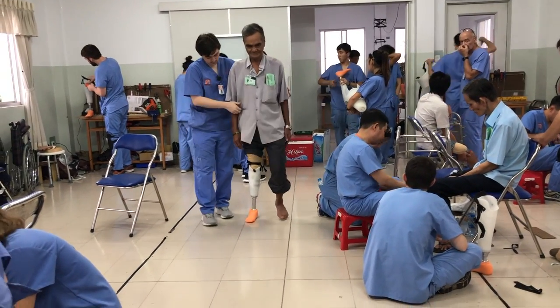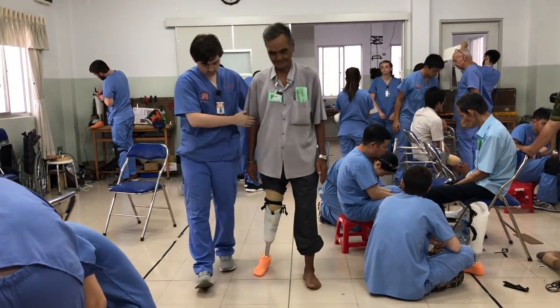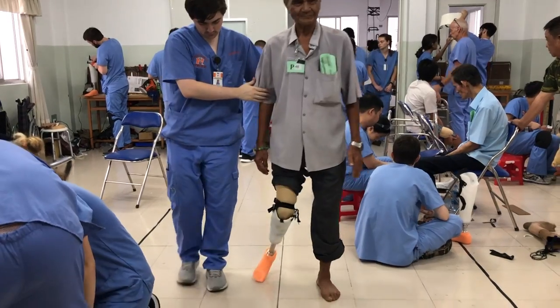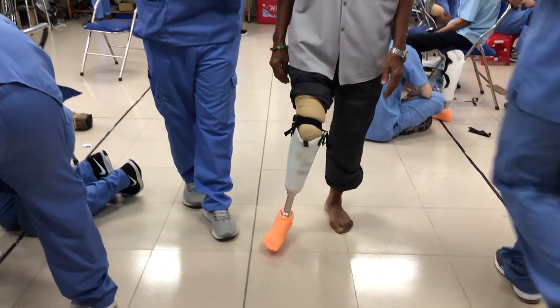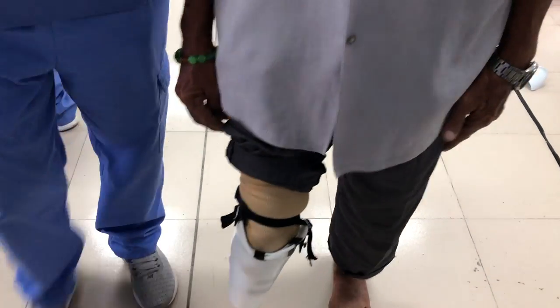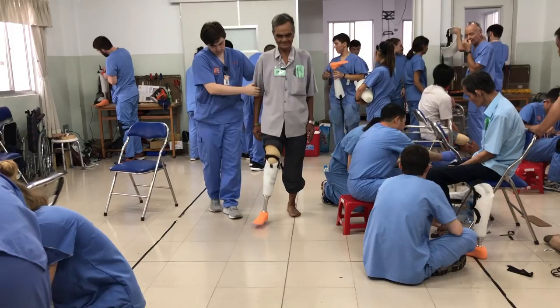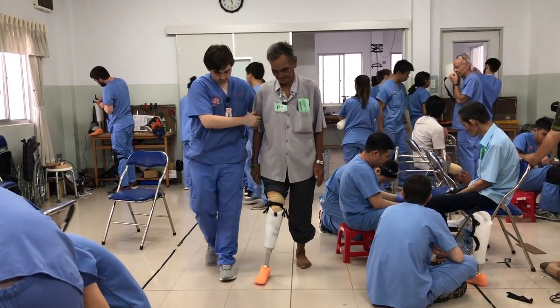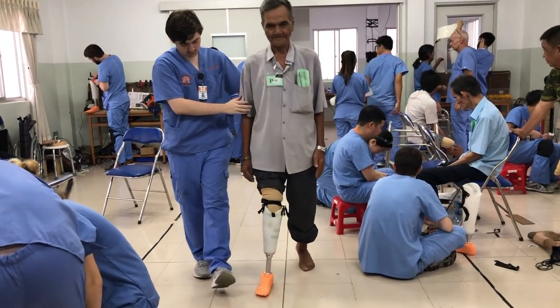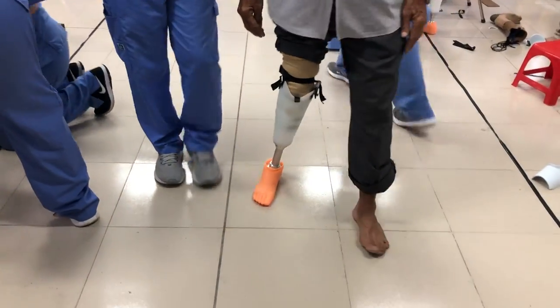Now, have the patient walk and make any corrections for comfort, valgus or varus, or loose straps. You can see that as our patient walks, his leg is still valgus. To correct this, we added foam on the medial, distal side of his stump and on the lateral wing and cut holes in the foam where the bony protrusions were. We also tightened the medial strap and flared in the lateral wing.